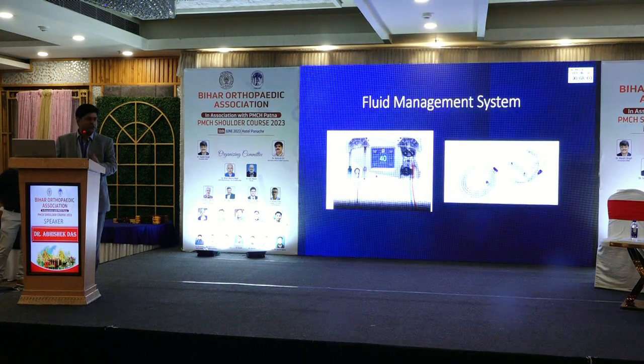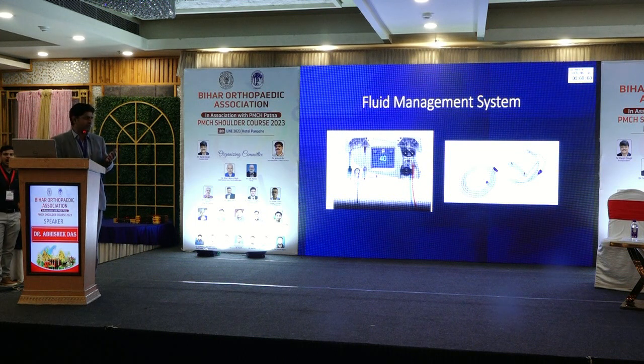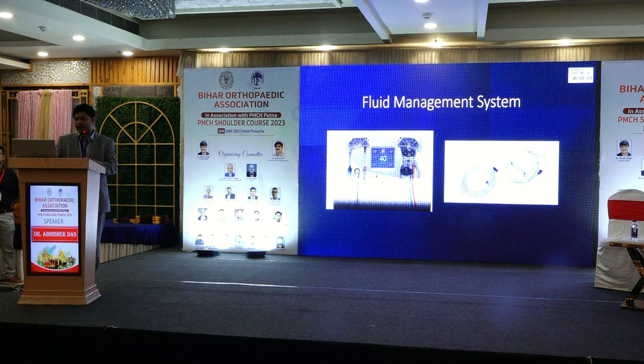Okay, fine. The other most important thing is the fluid management system in the shoulder. In the knee, it is not that important, but in shoulders, you need a fluid management system to keep the pressure decent enough, because turbulence will again cause bleeding and your vision will go away. So a fluid management system where pressure can be controlled is very important, but then again, you will have to invest in the tubings and things which are probably not reusable.